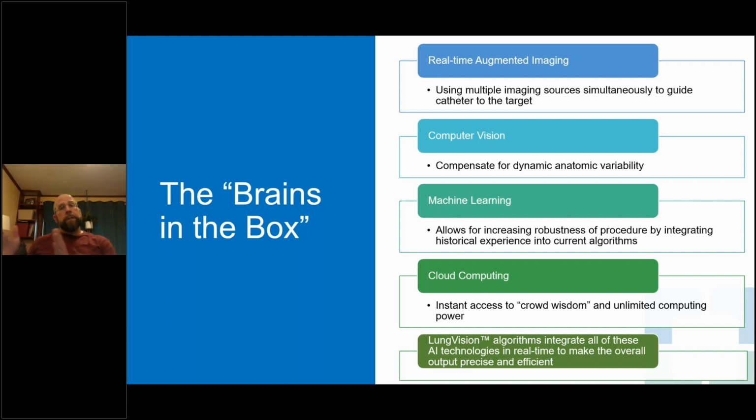And as you'll see some of these images later, the images are really fantastic and comparable to what you get from an actual diagnostic CT scan, even though you're just using a C-arm that we've all got laying around the hospital. And you know, everything is AI nowadays, right?